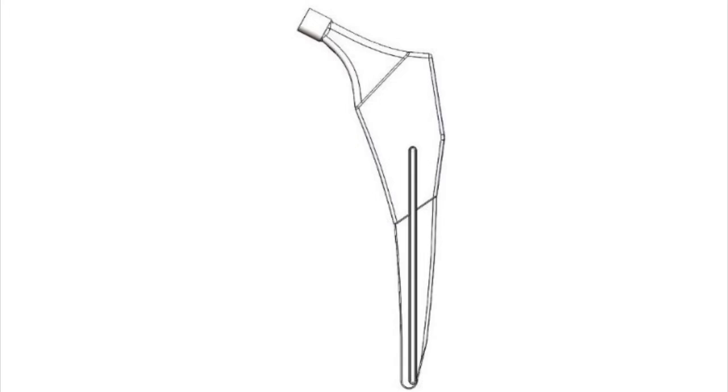In this design, as you can see, I took out the acetabular component and the plastic liner, and all that is left is the femoral head and the femoral stem. This is because in the testing I will not be considering the other components, and in this, as you can see, I can apply the load straight onto the femoral head without being disrupted by the acetabular component, because I wouldn't be considering that in my test. I will only be considering the femoral stem, which in this project is what I'll be analyzing.